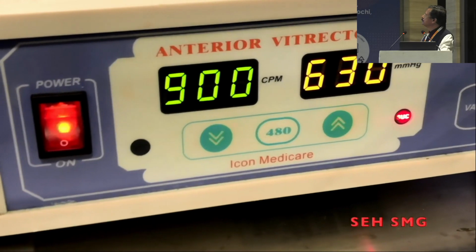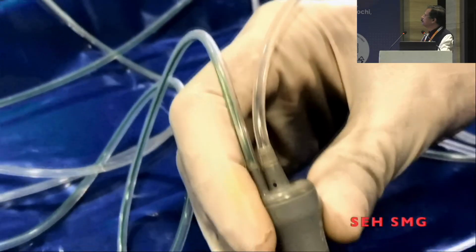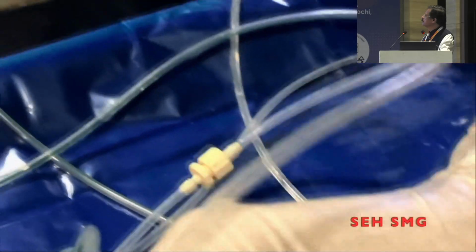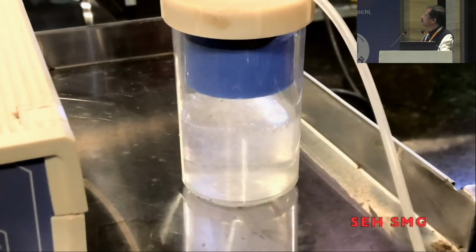To check whether the cutter is working or not, put it into a bowl containing BSS. First aspiration, press on the foot pedal. You can see the BSS getting aspirated and it is getting collected into the vacuum bottle. To check the cutter, you have to see the tip of the cutter. It will be oscillating to and fro. That means it is cutting correctly.